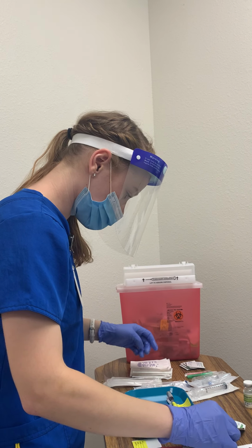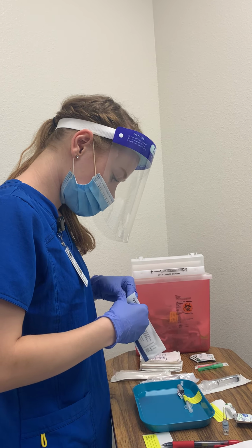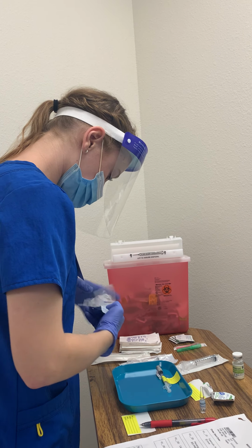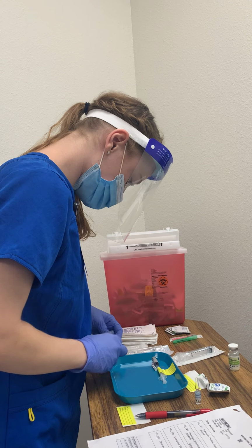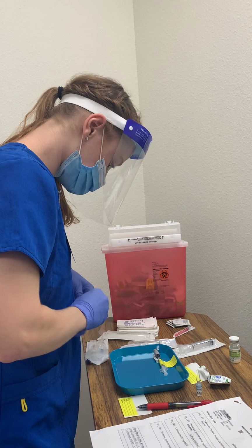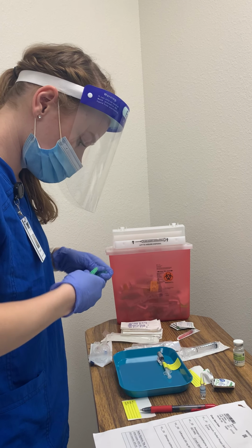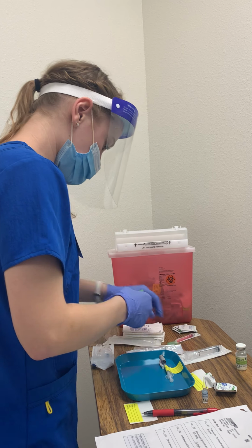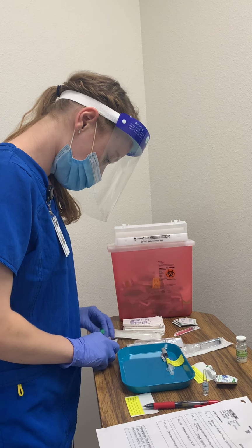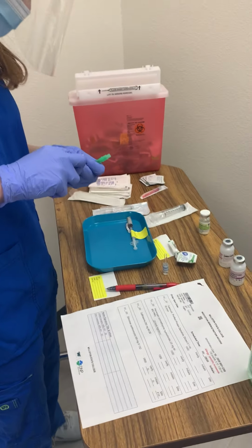And then I'm gonna get my needle ready. There we go. And I'm going to be looking up from the right end.